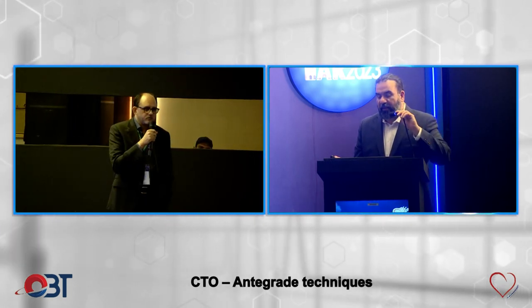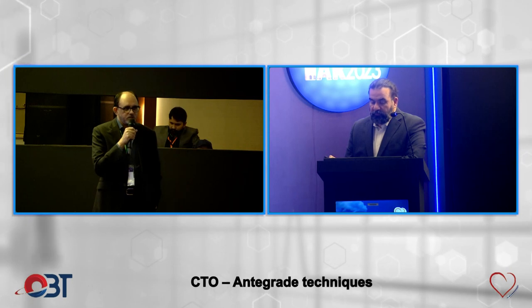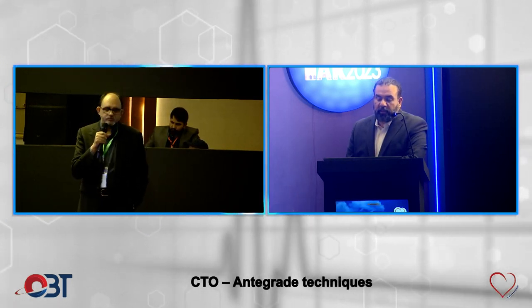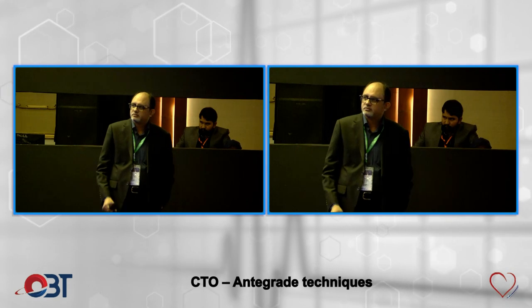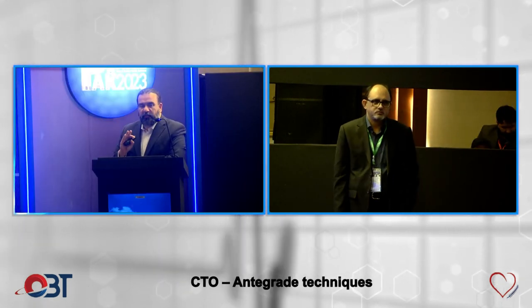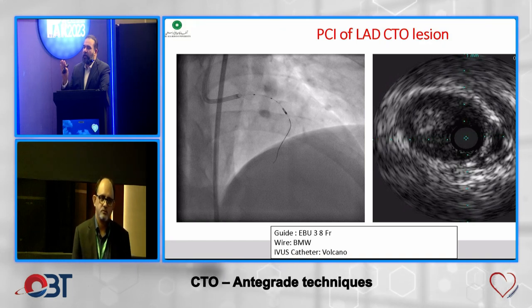Aapko nazar aa raha hai ki yahan pe IVUS pe. So if you can appreciate between 9 to 12 o'clock position, at 10 or 11 o'clock position, you can see the LAD. So in this position, you can see what your goal daira hai adjacent to the IVUS catheter. That's your occluded cap. Now, I will ask Tarek bhai this question because I use a technique which he taught me. Ki agar aapke paas IVUS na ho, then how do you engage the cap?